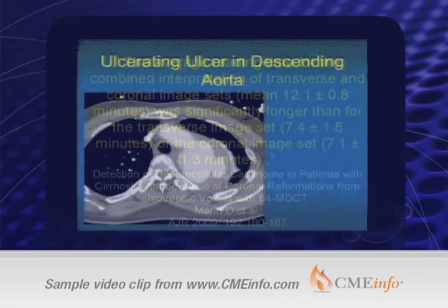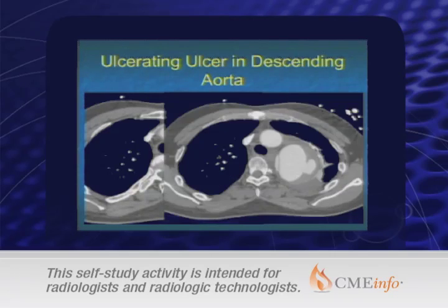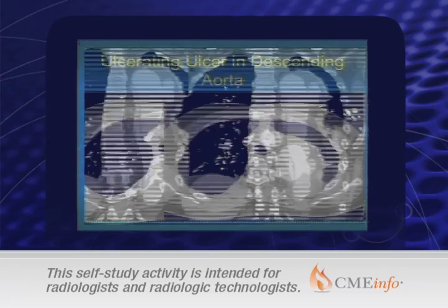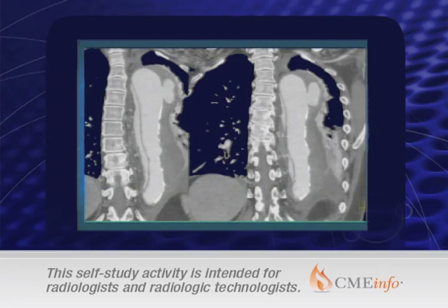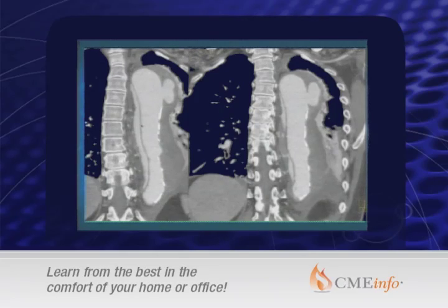A case like this just shows why it saves you time. You're looking at a patient with chest pain and back pain, looking for dissection. You see a dissection, you see this ulceration here, it looks like intramural hematoma — you're trying to figure out exactly what's going on. You can look at all the axial imaging, but you look at just two coronal images and you really get the full picture: there's the ulcer, there's the intramural hematoma, there's the dissection. Your interpretation is typically more correct and more informative.